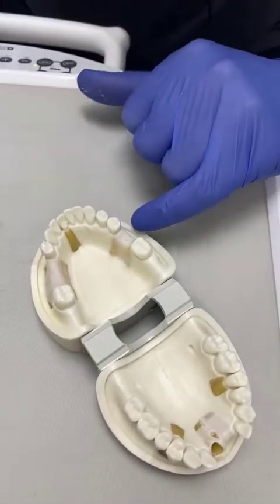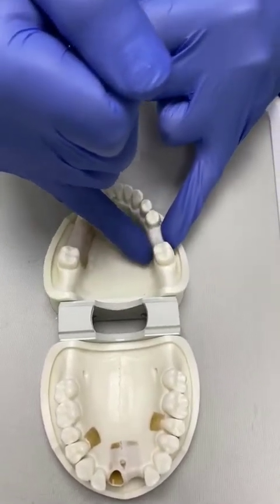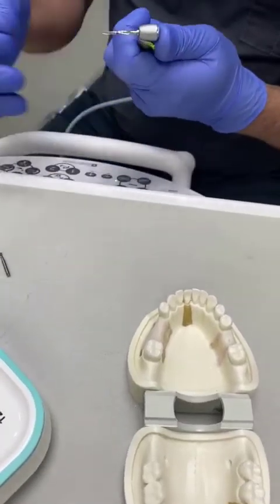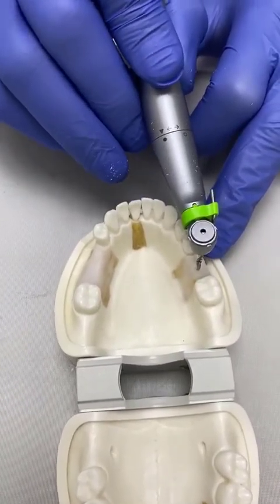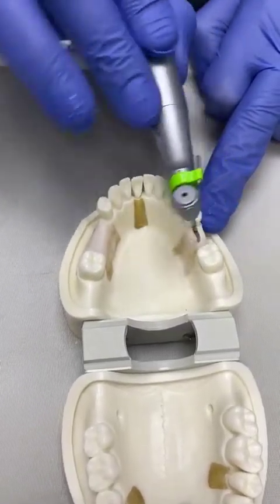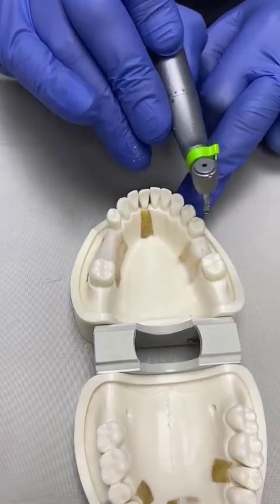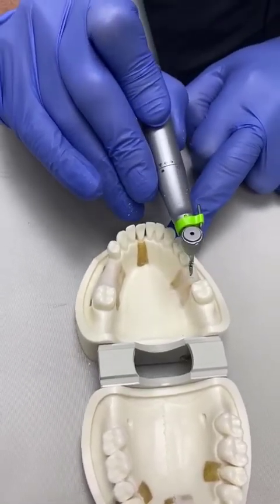I would normally stop around there — even in real life I would stop there, start measuring things, and ask the patient to close to check that I'm aligned with the cusp tip of the opposing cusp. I look at it from an occlusal view, from the mesio-distal viewpoint, and from the buccal-lingual. In this example it is going to be in the middle of the ridge because the plastic model has been designed that way. We then develop this osteotomy and get our angle — first getting the position on the ridge, then developing our mesio-distal inclination and our buccal-lingual inclination. We need to line this up with the axes of the roots of the neighboring teeth.